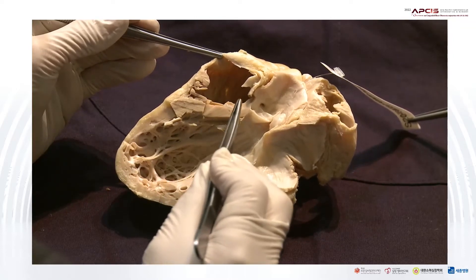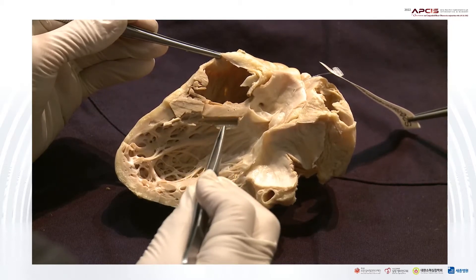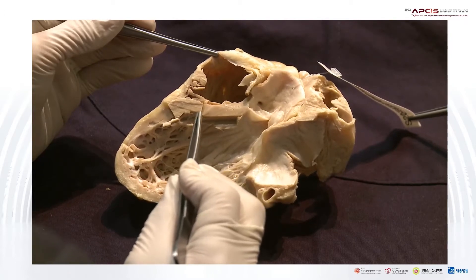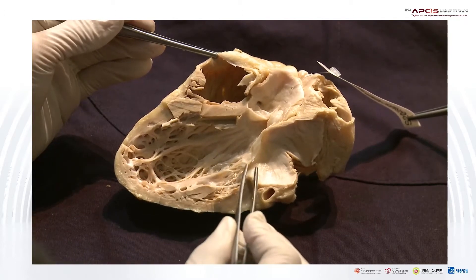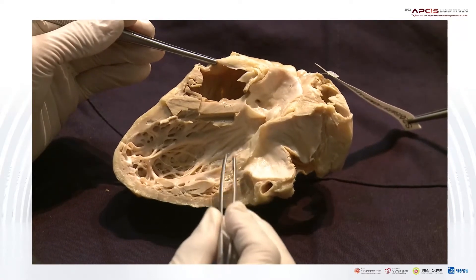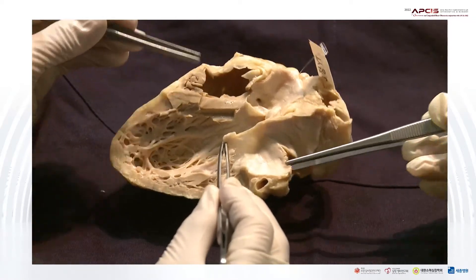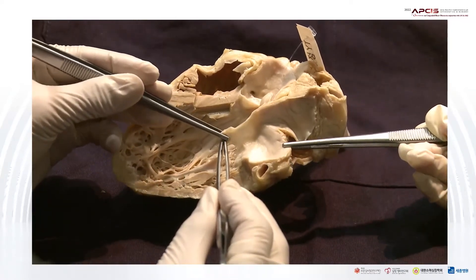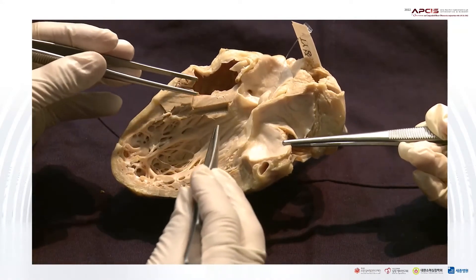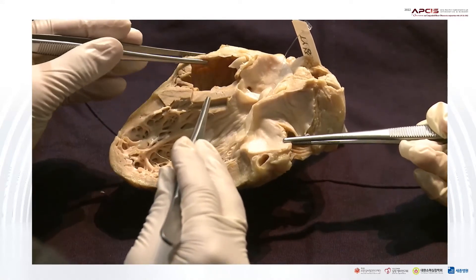I sectioned the specimen many times to find areas where I could identify myofiber disarray and also central scars in the hypertrophied area. I could also see similar changes at the tip of the anterior mitral leaflet, which was very much thickened. There was some scar in this area, which I suspect is one piece of evidence.